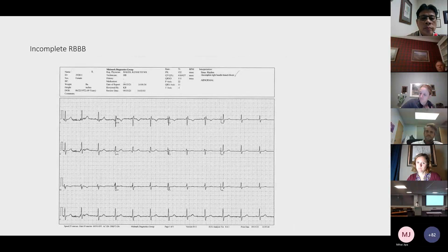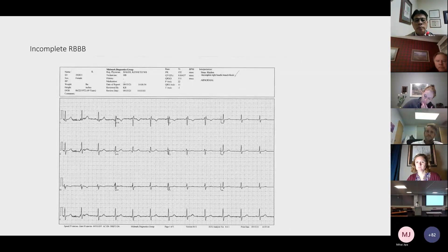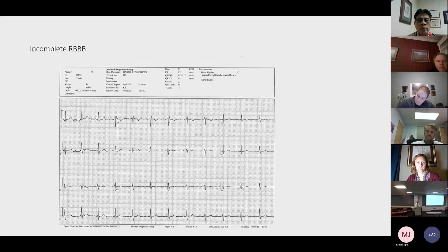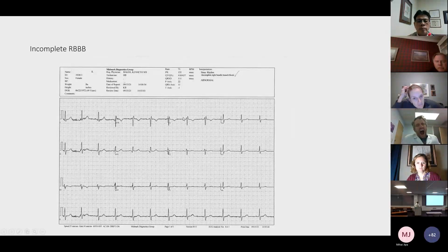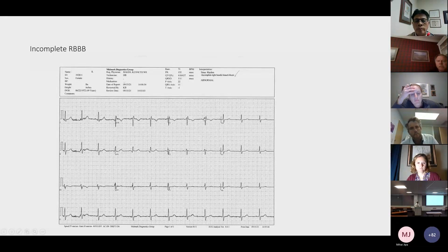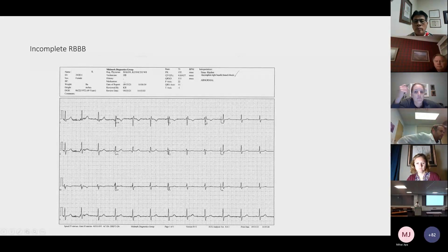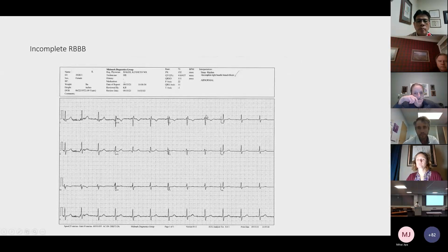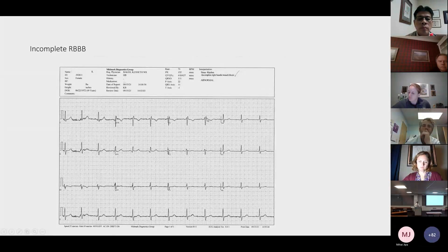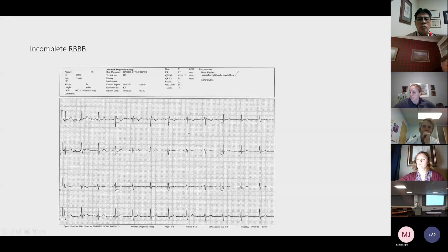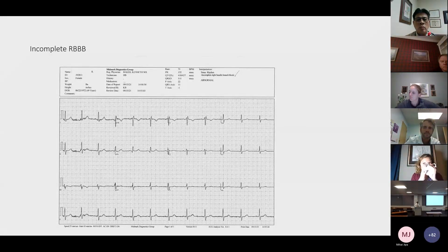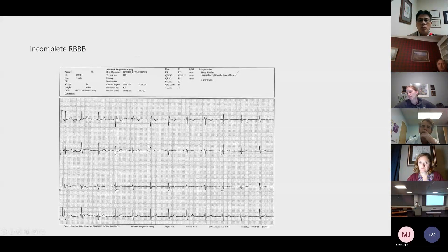Right bundle branch blocks — a quick review on incomplete right bundle branch block. We see a lot of these and the computer is pretty good at reading them. We look at the RSR prime or the double peak in V1, sometimes V2. I like to tell patients there's a delay in the signal: the wave of depolarization is passing, then here comes the second part — the delay triggers its depolarization signal, giving us two peaks. That's your incomplete right bundle branch block, as opposed to complete, which has a wider QRS. The QRS duration here is nice and narrow.